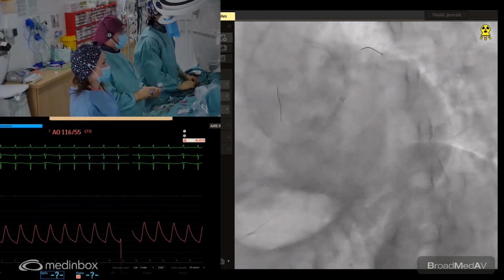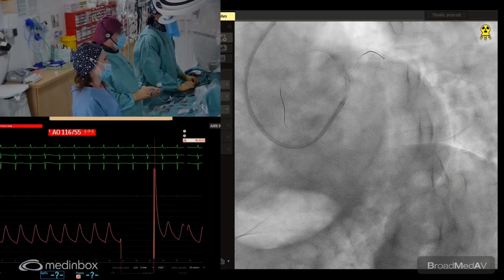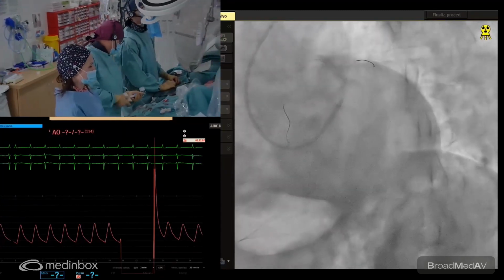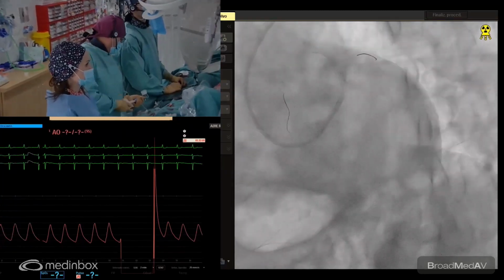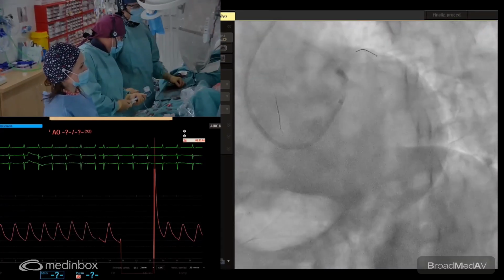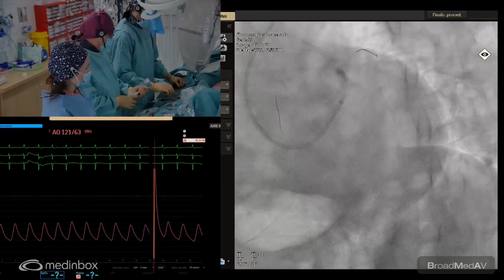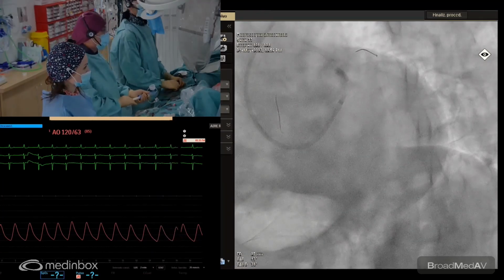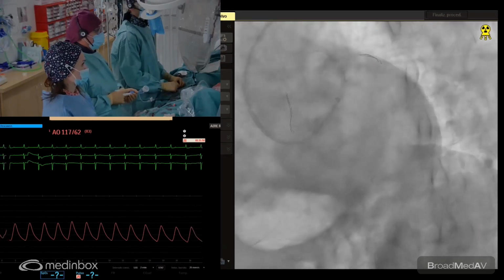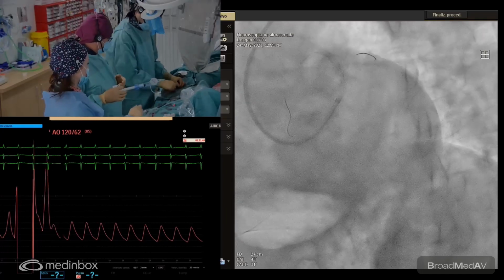Test, Patri. I think that's... I'm there, okay? Dale, 18 si quieres. Perfect. 18. Perfect. Down. Blood pressure is okay. ECG is okay. Let's retrieve the balloon. Test, please. All diagonals are there.